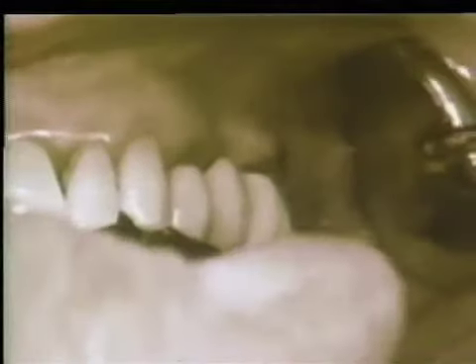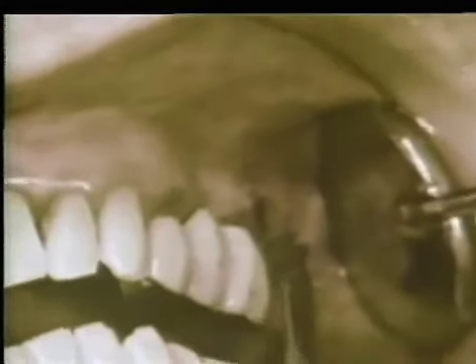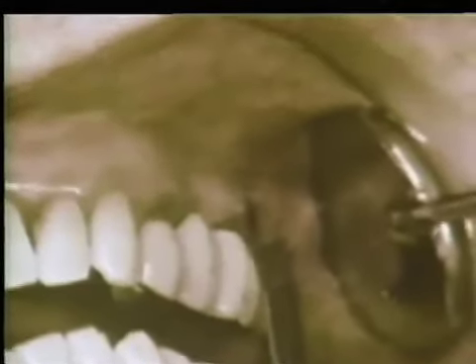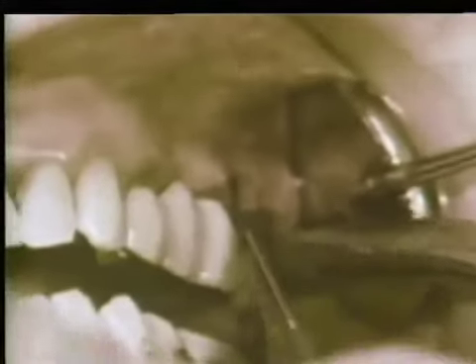The scalpel again follows the penciled outline at the donor site. This will be a split-thickness graft of attached gingiva that must be carefully dissected from its underlying connective tissue bed. The connective tissue itself is split so that the lamina propria remains with the graft.